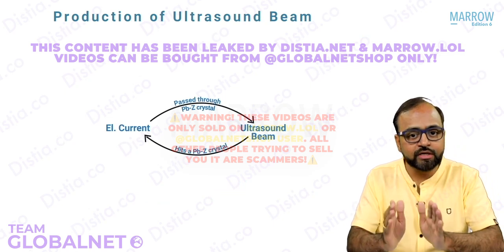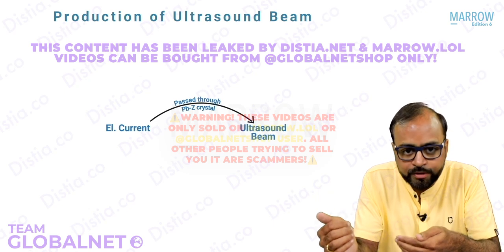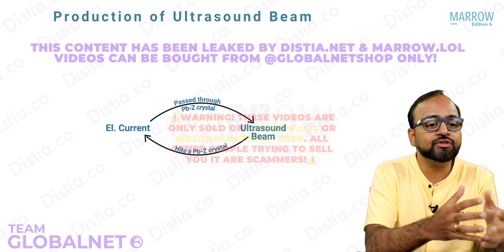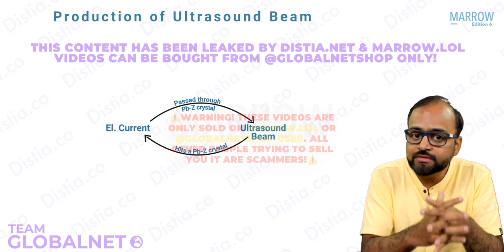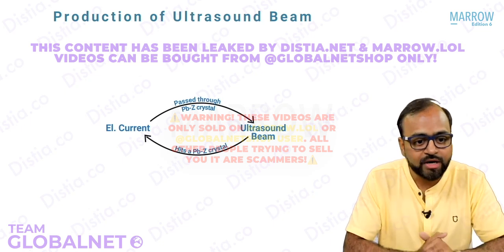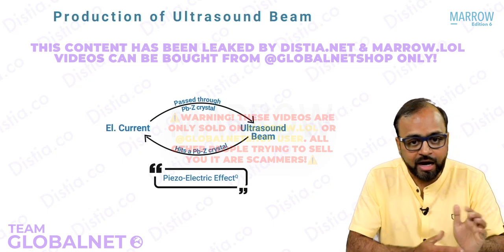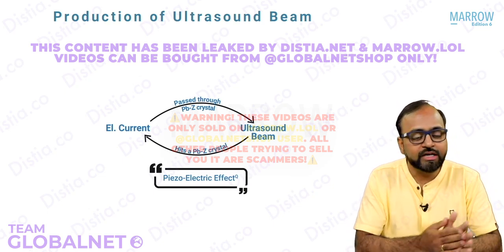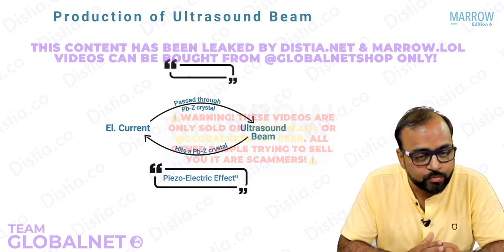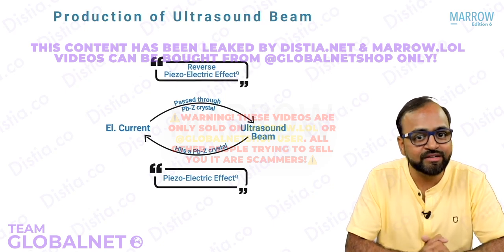So this event that we've just discussed, that is, an ultrasound beam when it hits a lead zirconate crystal gives rise to the generation of an electric current, is the basis of ultrasound, which is called the piezoelectric effect. And the one that we studied right before, that is, an electric current passed through a lead zirconate crystal results in formation of an ultrasound beam, is called the reverse or inverse piezoelectric effect.